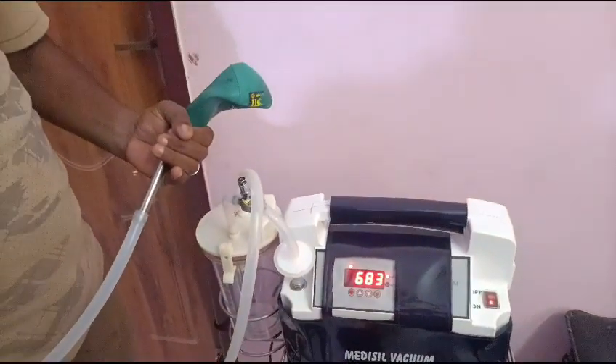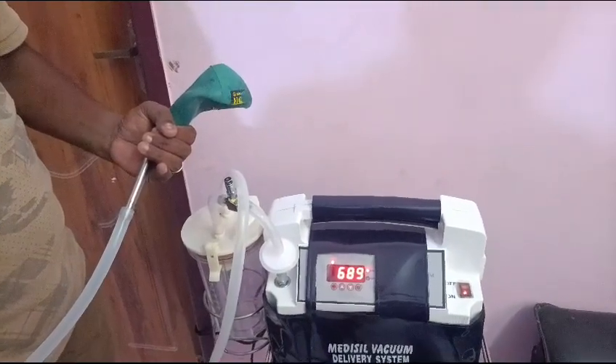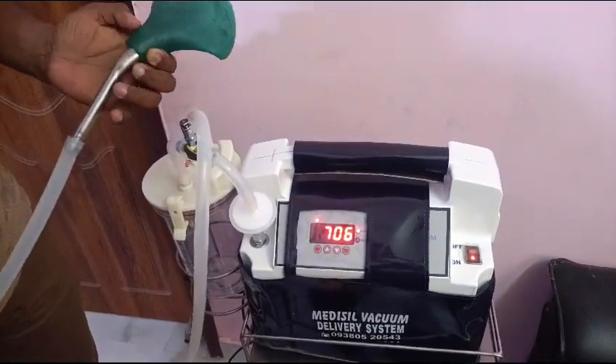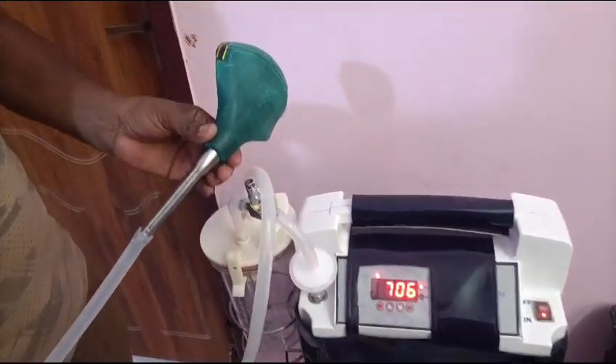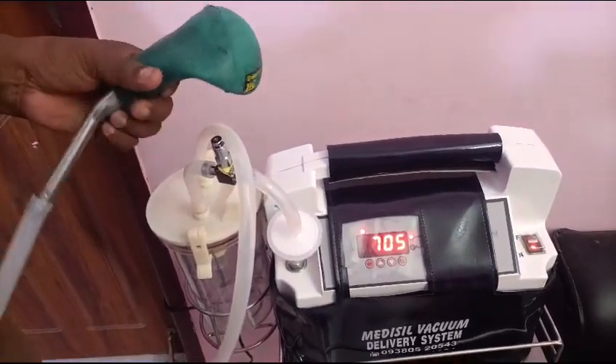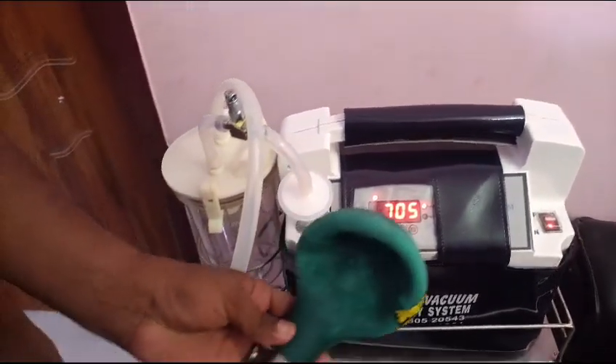If you go to 700, this machine is rightly suitable. So it is a controlled procedure. Once you go to the high pressure, you stop it and maintain. It will maintain as it is — the vacuum will maintain as it is.